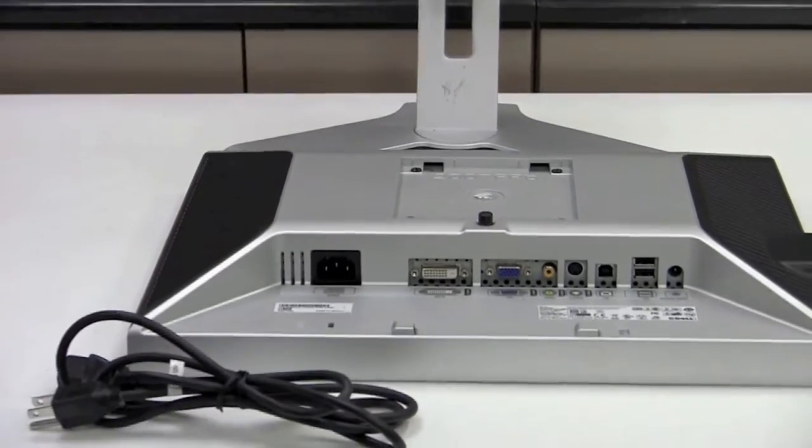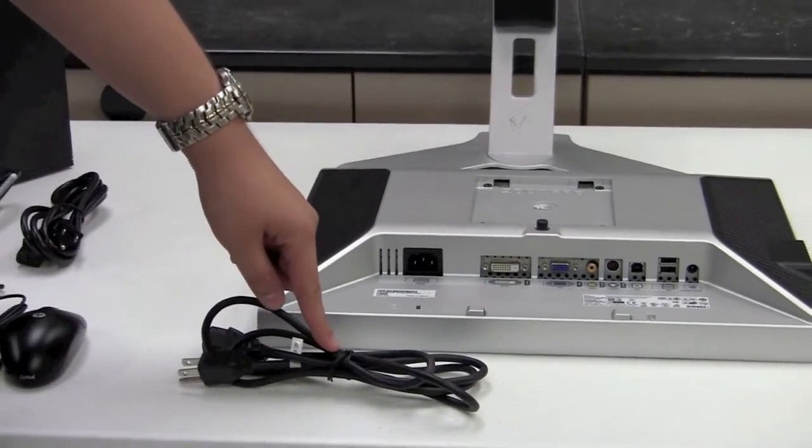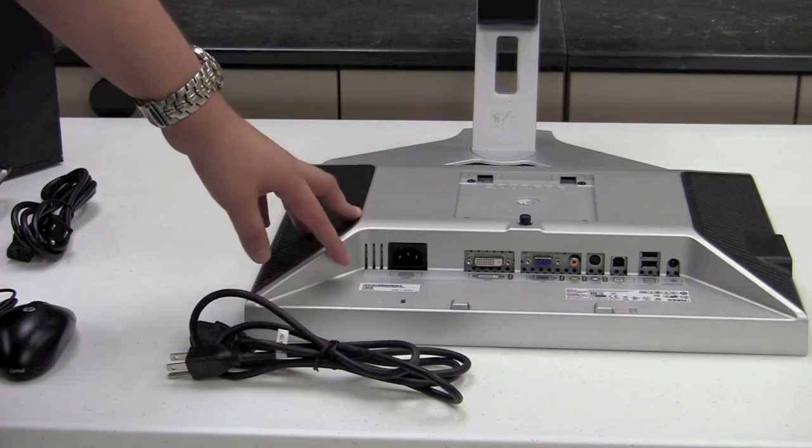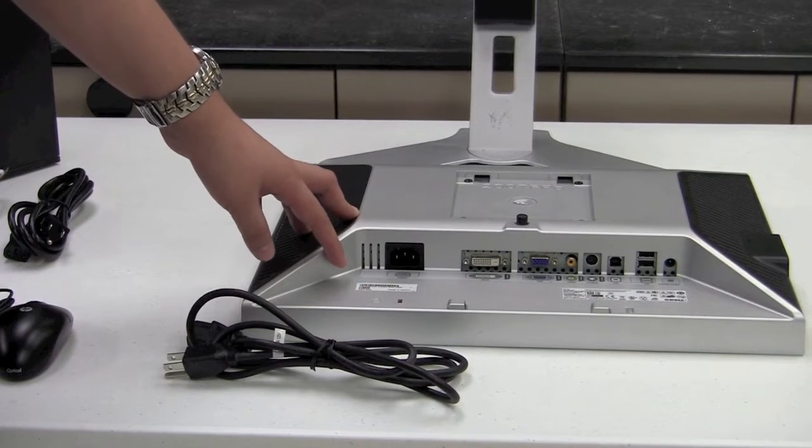The second cable we're going to use is the power cable. We'll set this up with the computer monitor on the base when we get to that point of the setup.